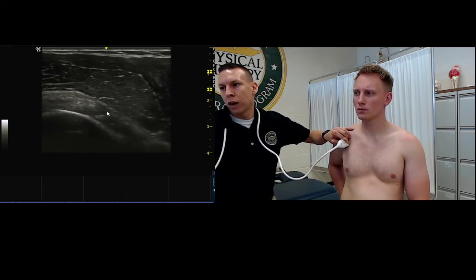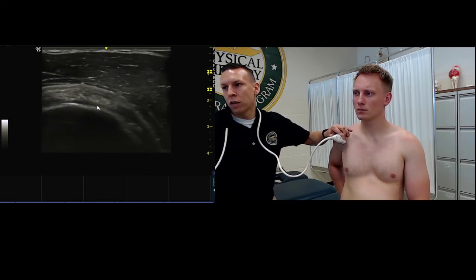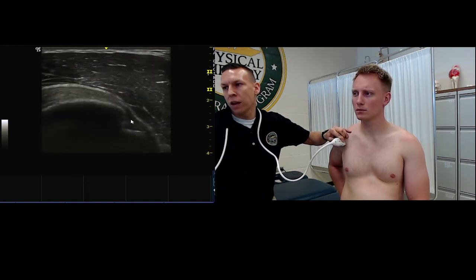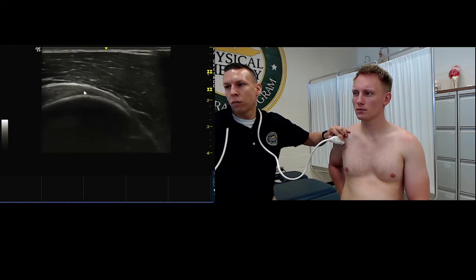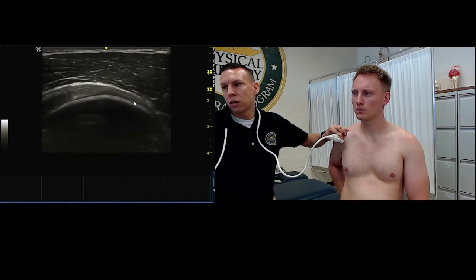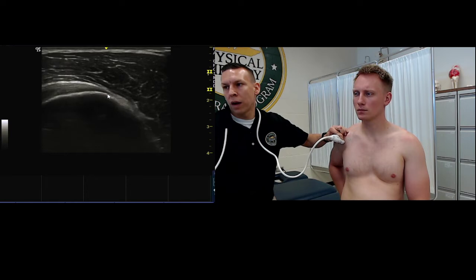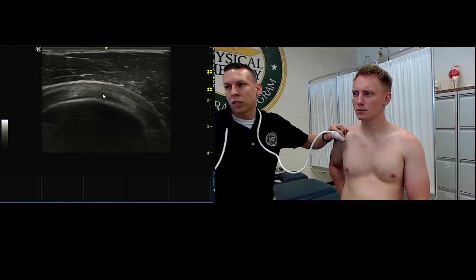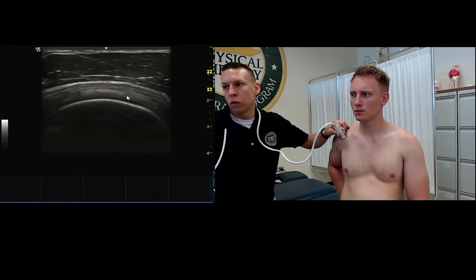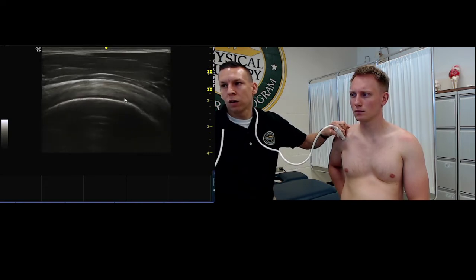And so we should be able to identify a little bit of those, but right now we're not too concerned with that, with these scans. And so once we're here, we find that biceps tendon, we want to locate the tire on the wheel, and then we want to slide all the way till you run out of the attachment, and then come back up and look for any kind of tears in that footprint. Here's this tire on the wheel of the supraspinatus. We want to look at it from anterior here to posterior.